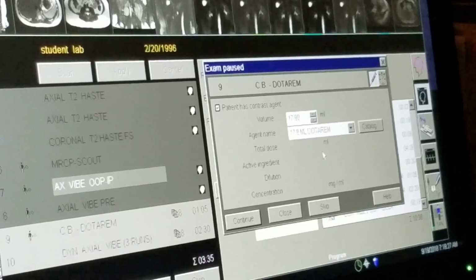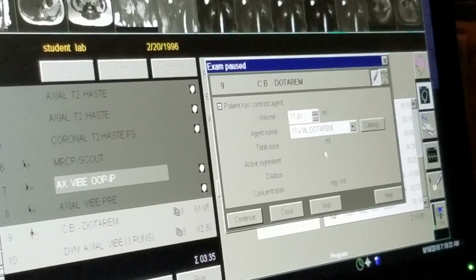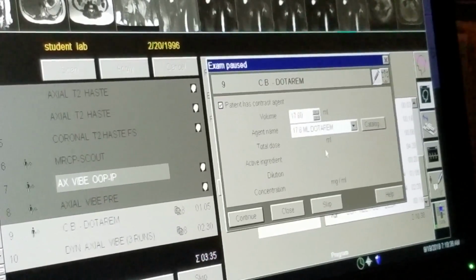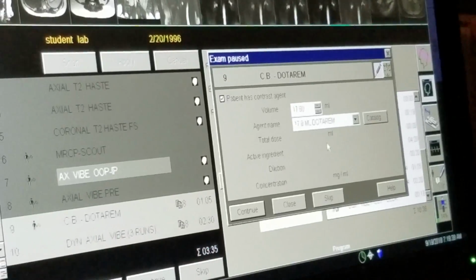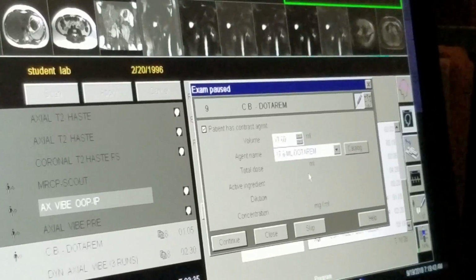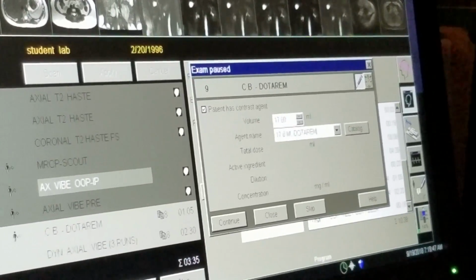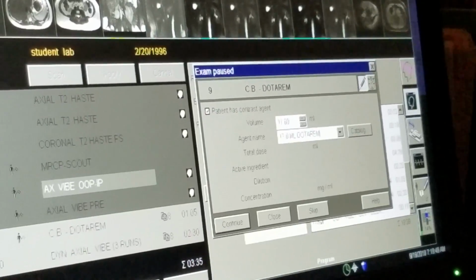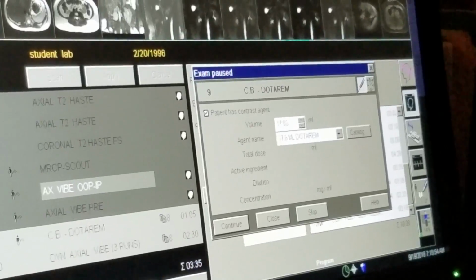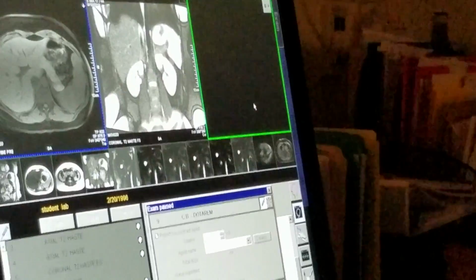So I always tell them the noise of the scanner is going to begin first. And then after quite a few seconds, because that's the time where we're watching the contrast go in, we'll tell them to take a breath in and hold it. So that said, the power injector is now armed. We're annotated for contrast. When we hit continue, we're going to see that one slice imaged over and over again. It's a sub-second resolution, so just under a second it's going to refresh with a new slice, which will allow us to see the contrast circulate.